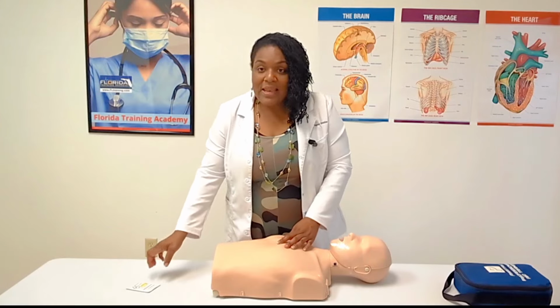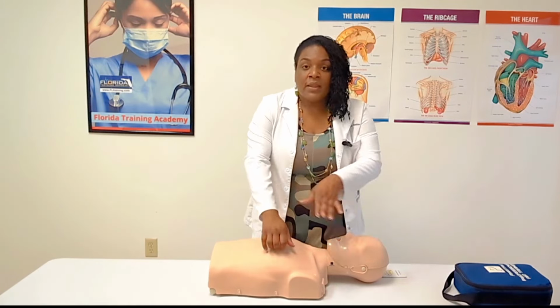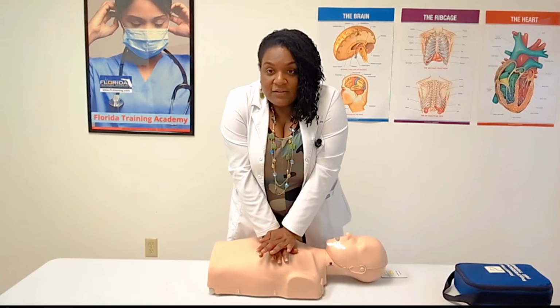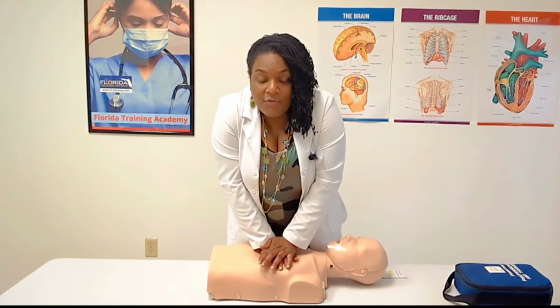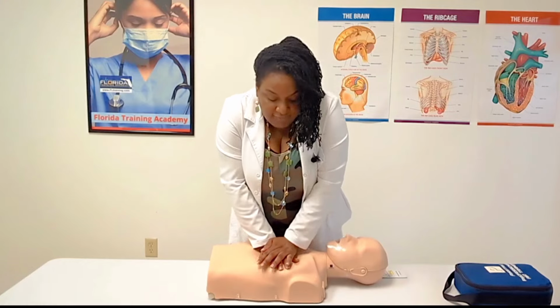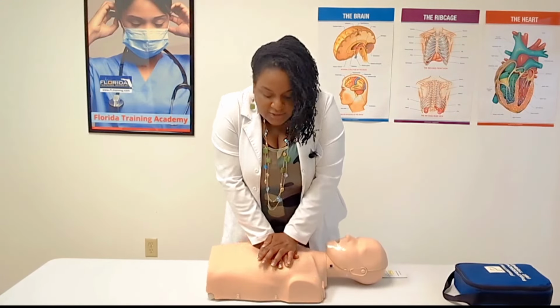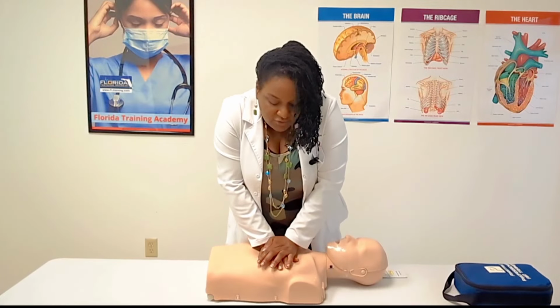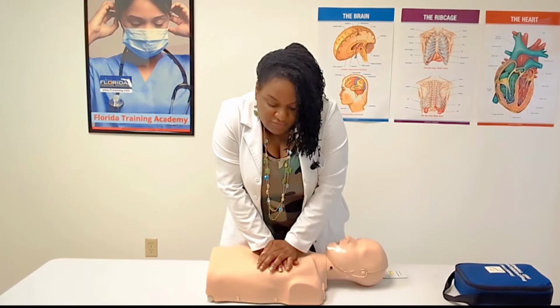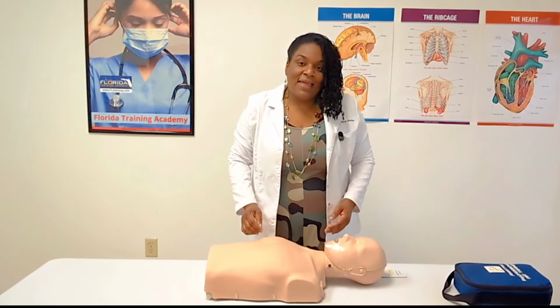So we're going to go ahead and do a quick demo on just chest compressions. Interlock, hands in the center of the chest, lock those elbows. 1, 2, 3, 4, 5, 6, 7, 8, 9, 10, 11, 12, 13, 14, 15, 16, 17, 18, 19, 20, 21, 22, 23, 24, 25, 26, 27, 28, 29, 30.